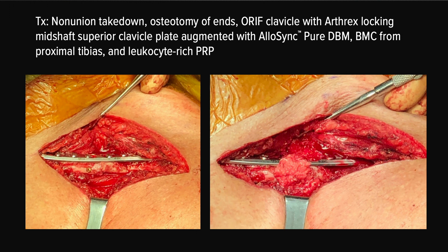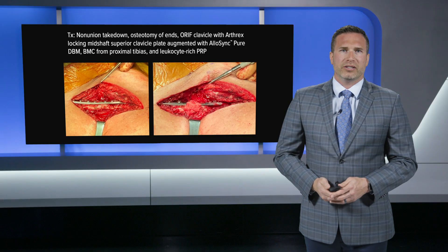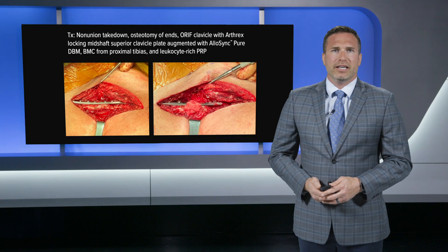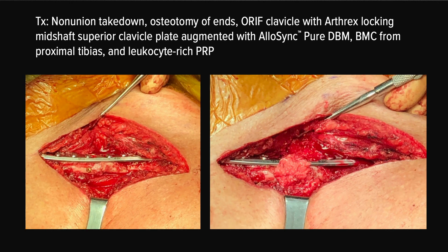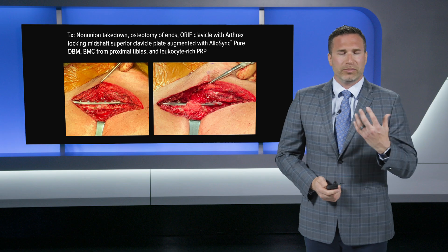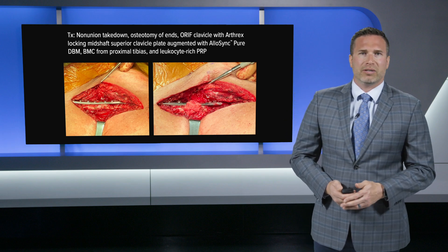The treatment was surgery — a non-union takedown. I found a fibrous type non-union between the two ends. I performed an osteotomy, cleaned up both ends, and got good bleeding bone. I did an open reduction internal fixation with a superior plate and augmented this with biologics. The biologics I chose were AlloSync, which is a DBM that is pliable. I mixed it with leukocyte-rich PRP that was neutrophil deficient, as well as bone marrow concentrate from his bilateral proximal tibias. This formed a very nice putty, which you can see surrounding the fracture area.